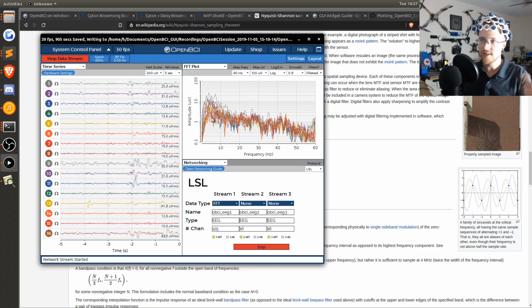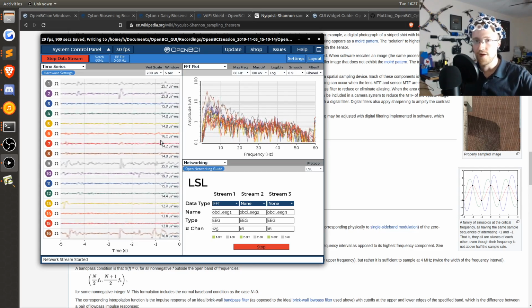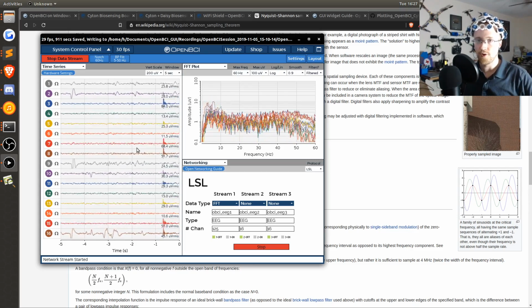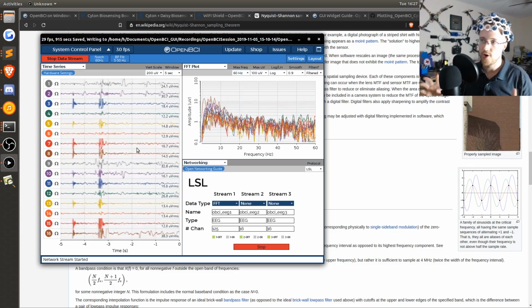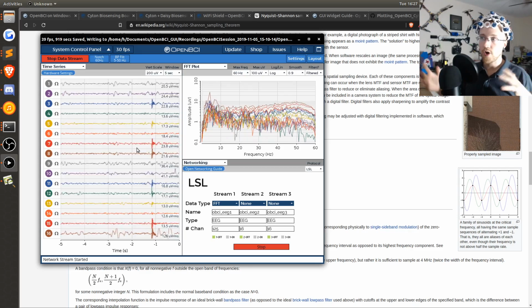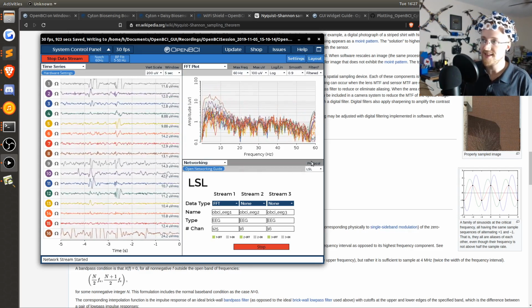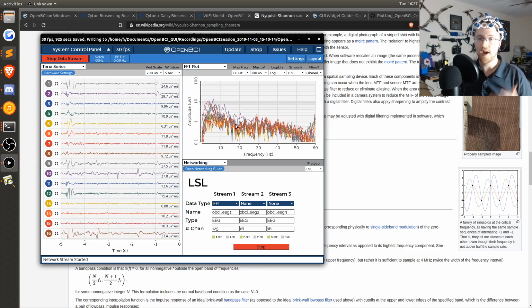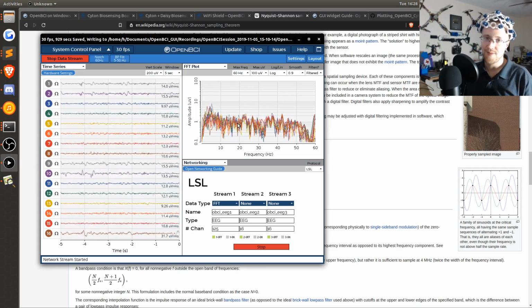Initially, I was thinking just left, right, but then the question was, we're probably getting a lot of noise here, so maybe introducing a third action, none, would help the neural network to determine what's truly left, what's truly right, and so on. So regardless, mostly it's just move left, right. Is that information present inside of here? I hope so, right? That is my premise.